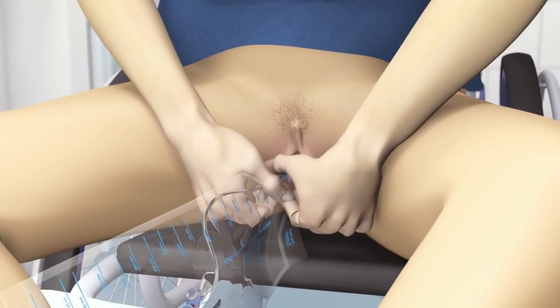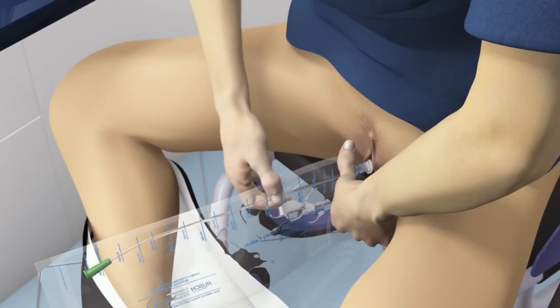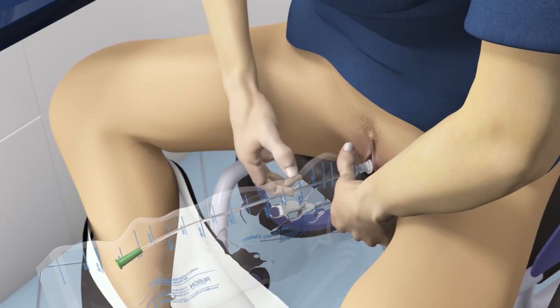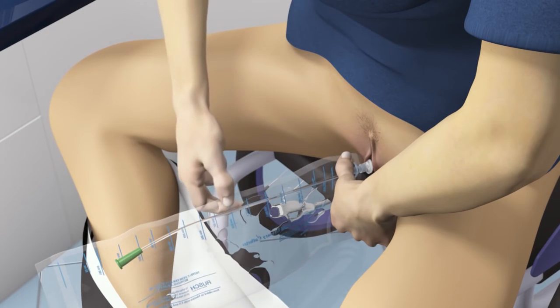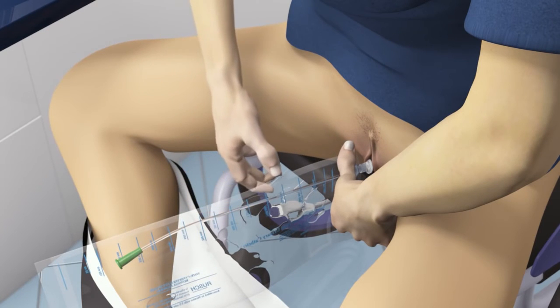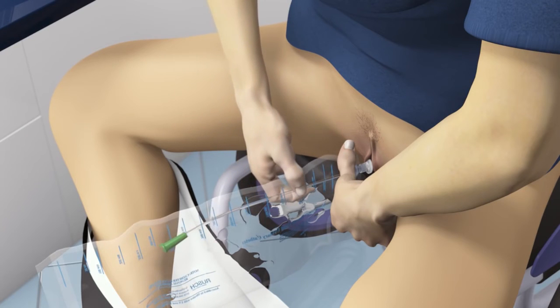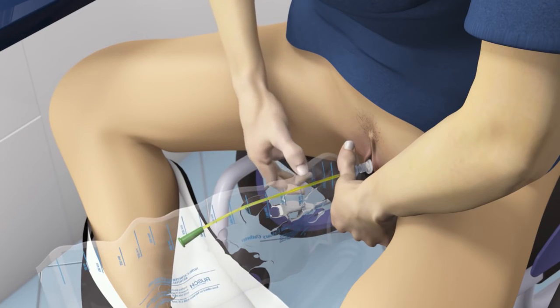Release the labia. Grasp the split introducer guide below the base of the silicone introducer with your left hand, freeing your right hand. Using your right hand, advance the catheter through the urethra at 1 to 2 inch intervals. After each push, squeeze the guide and stabilize the catheter. Then straighten the bag with your right hand.